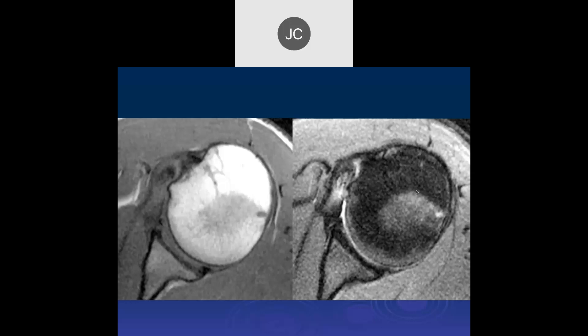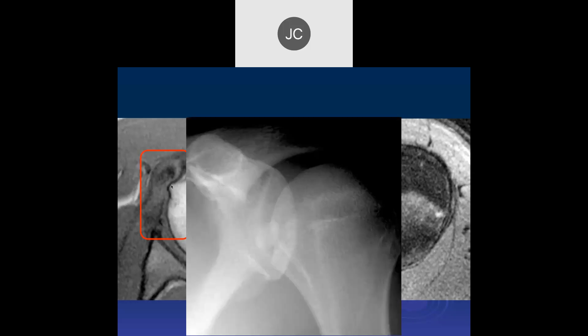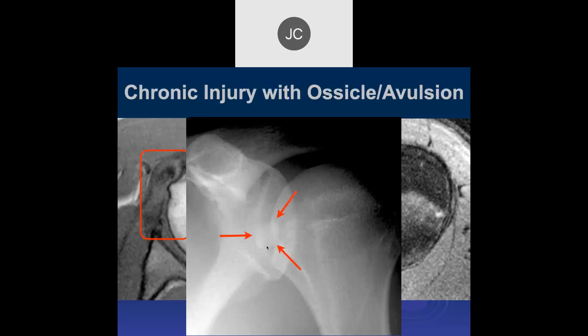Looking at the subscapularis again — a lot of thickening and edema of the tendon, and irregularity of the bone. On the sagittal, we see a bone fragment in the tendon fibers — another bone avulsion. There's the x-ray confirming it. In this case it was chronic.